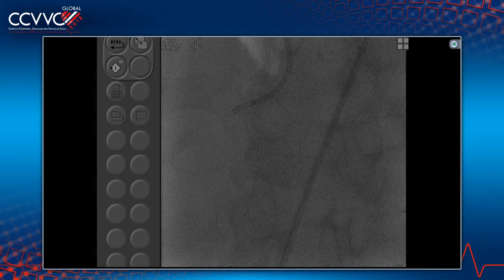And if these wires don't work, then of course we have the super stiff Astato wires, which come with a 20 gram tip, as well as a 30 gram and a 40 gram tip. Astatos. They're ready with IVUS. Meanwhile, let me just pre-dilate the distal.